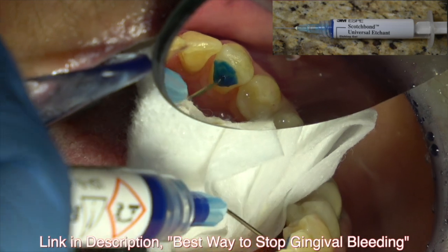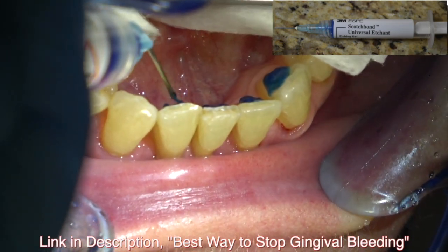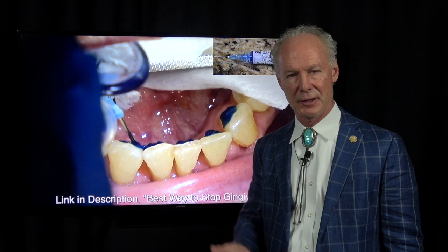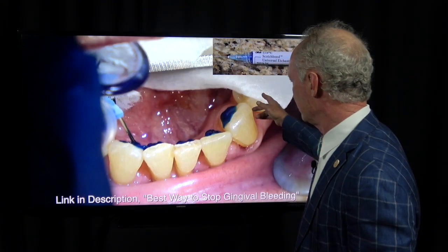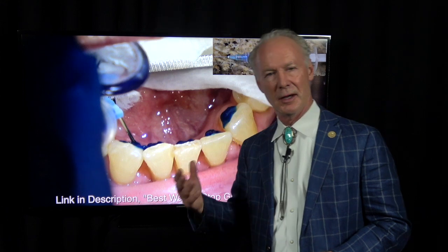Then I'm going to place 38% phosphoric acid on the lingual of the teeth. See how this tooth is mobile. I really like talking about these philosophic dilemmas — Dr. Pank used to always say you have to consider the temperament and circumstances of the patient. This patient had some dementia; she was older. It just wasn't in the cards to take teeth out and do a big restorative procedure. So what we're trying to do is preserve these teeth hopefully for the rest of her life, and this seemed like a real indication for a fixed lingual bar.